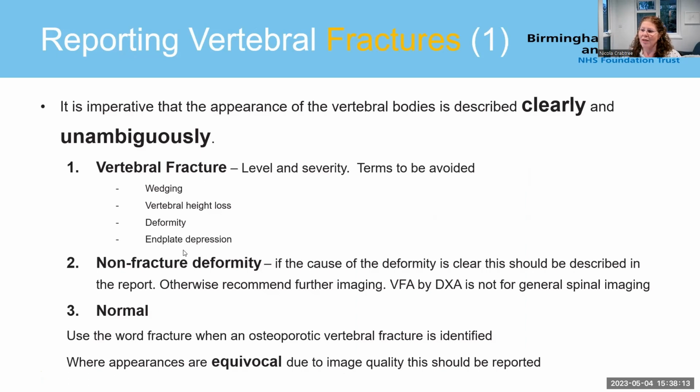In some recent work, a survey was done from reports from lateral imaging, and what happens is when these terms are used, the referring clinician is still unsure of whether it's a fracture or not a fracture, and then whether they should be treating or not treating. If it's a fracture, use the word fracture. If you don't know, if it's equivocal, be prepared to say it's equivocal and you don't know what it is.